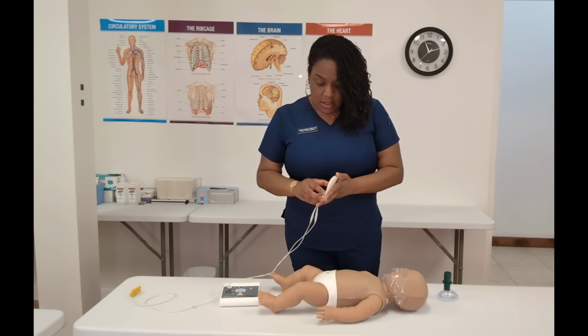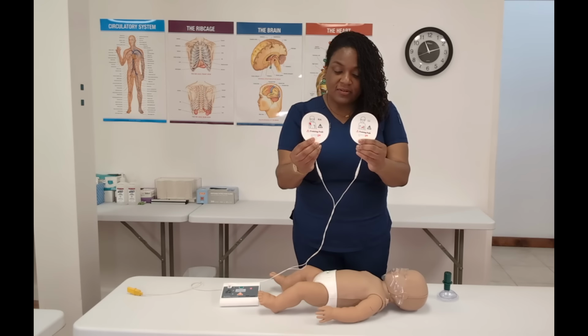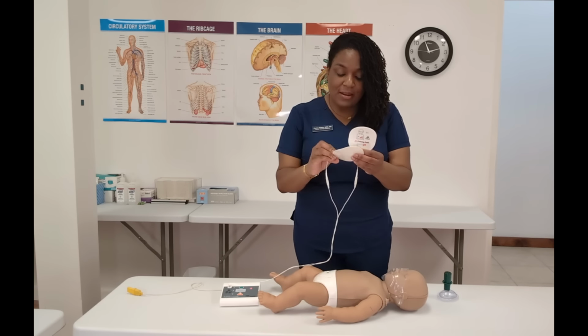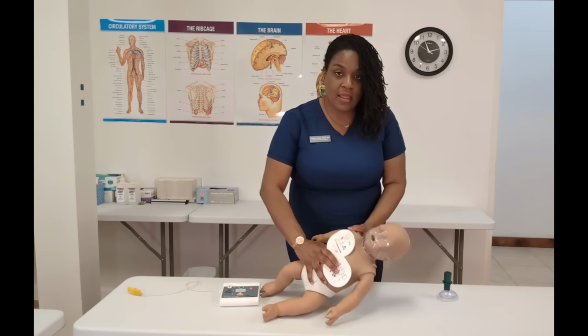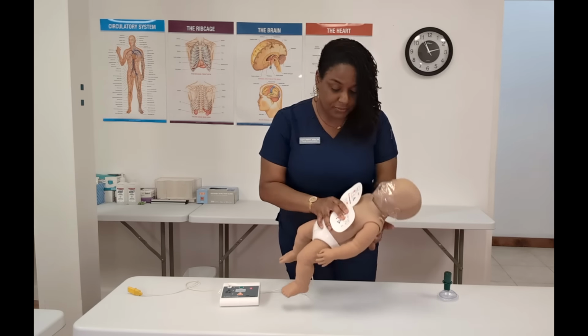Apply pads to patient's bare chest. Plug in the connector, listen to the prompts next to the flashing light. We have the smaller pediatric pads, but if we try to place them according to the pad images, the pads are going to touch, and that is not allowable.